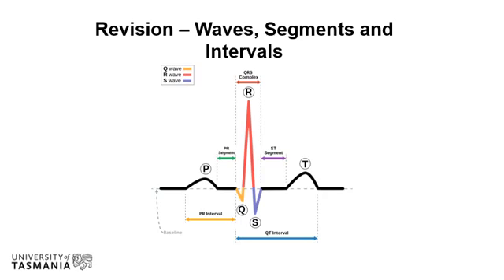Atrial repolarization cannot usually be seen on an ECG tracing, as it occurs simultaneously with ventricular depolarization. And if we think back to a couple of slides ago, we're looking at the result of that dominant mass of the ventricles as opposed to the atria. So it's creating a much more dominant electrical signal, which is represented as a QRS complex, and it's hiding that atrial repolarization.